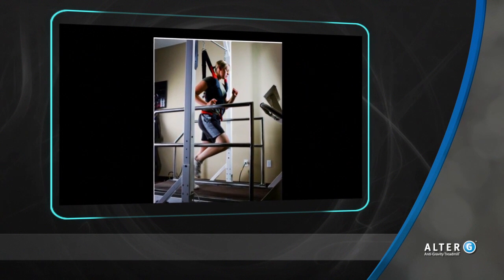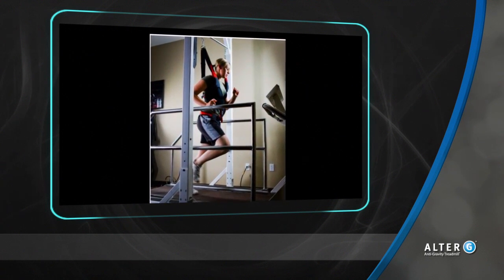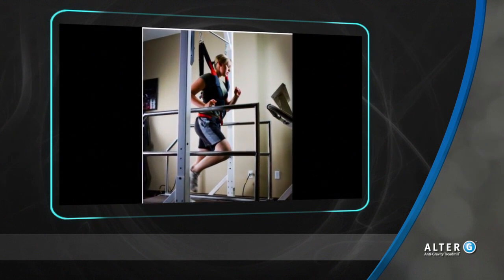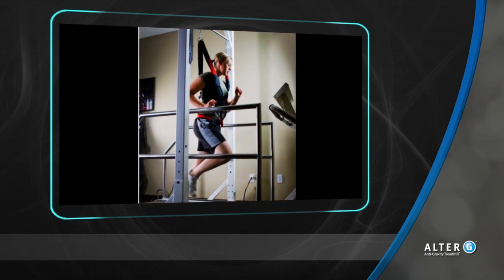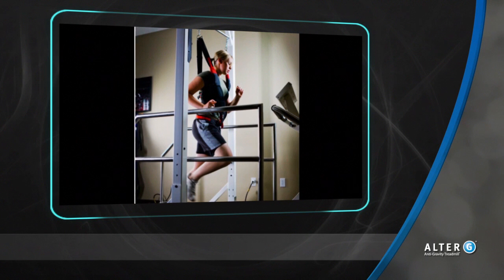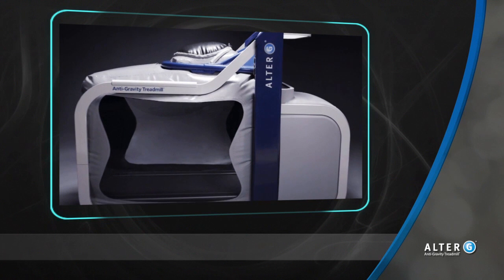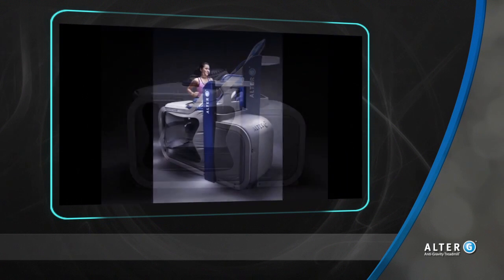After an injury or surgery, most patients try to reduce load to the involved lower extremity. This affects strength, proprioception, and overall function of the injured area. With the Alter-G anti-gravity treadmill, users can begin to safely load the lower extremity sooner after an injury or surgery.